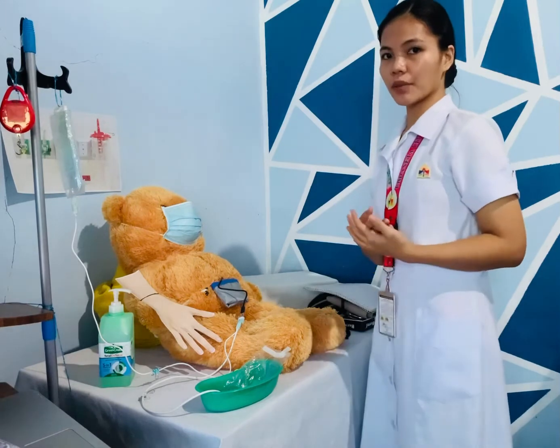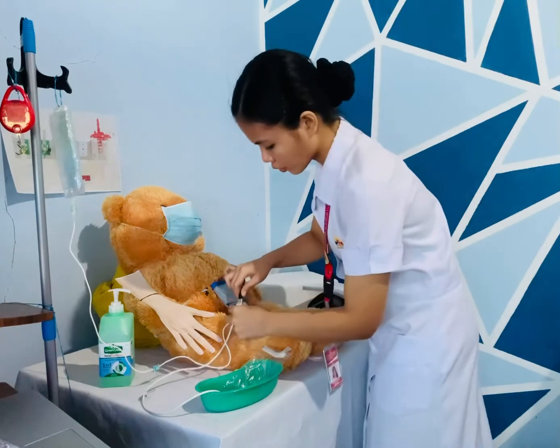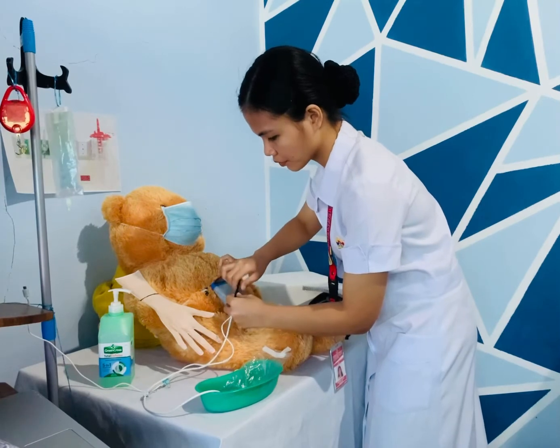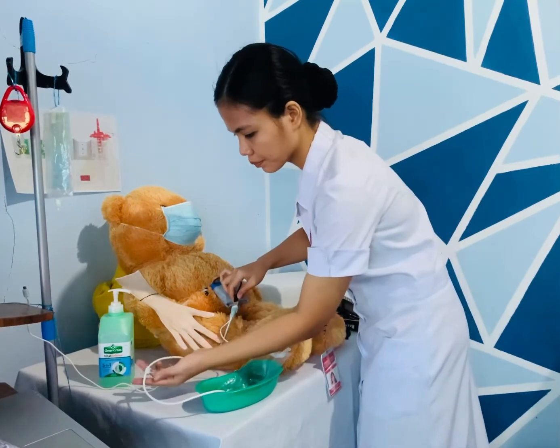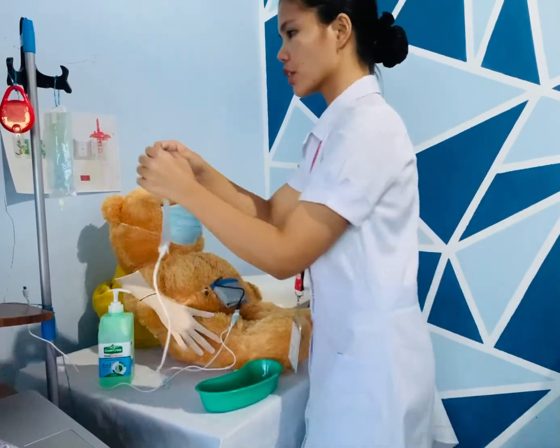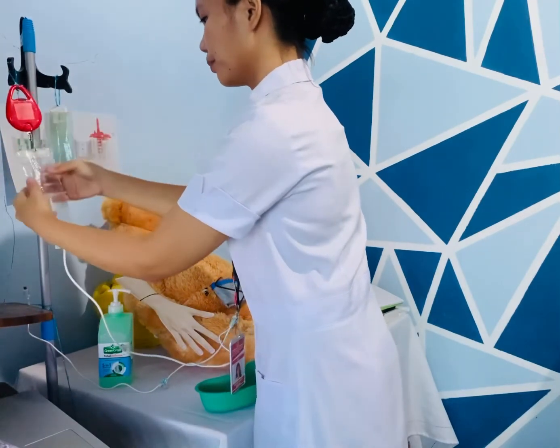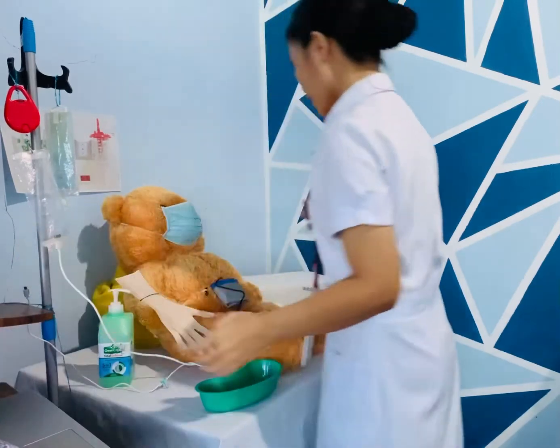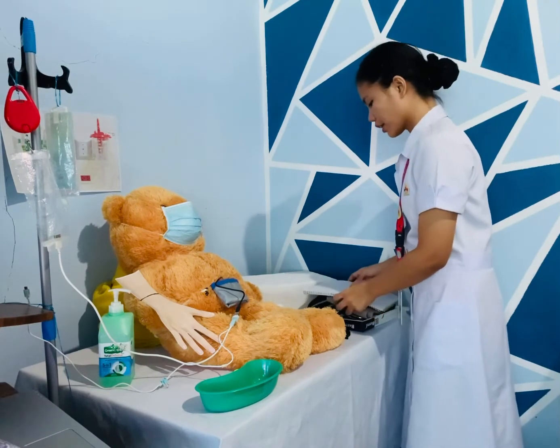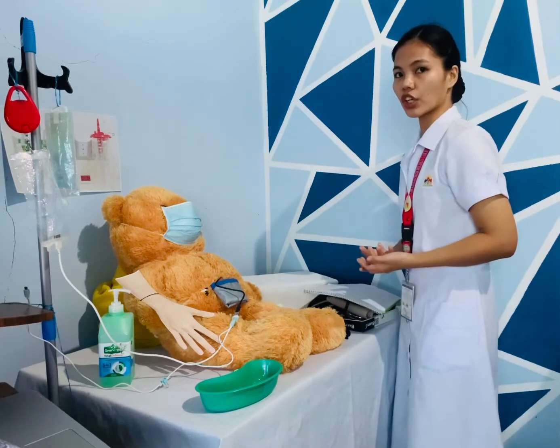Okay, so after 20 minutes, draining is completed. Close the twist clamp of the transfer set. Then close the white clamp. Then after that, weigh the amount of drainage. Then check the clarity of the drainage. Ayan. Then next is to document the amount of drainage, time taken to drain, clarity of drainage, and balance calculation in the record book.